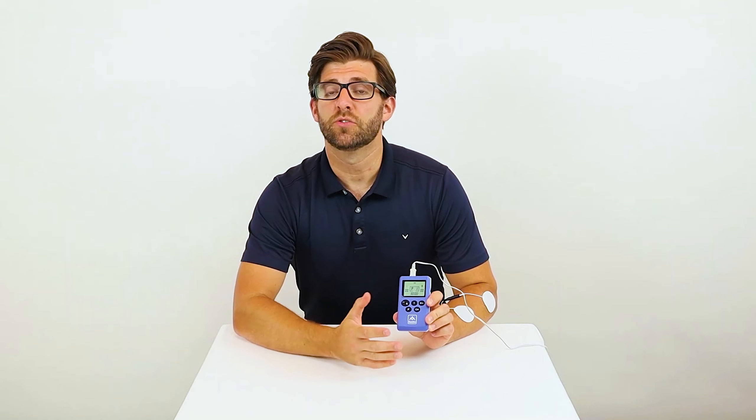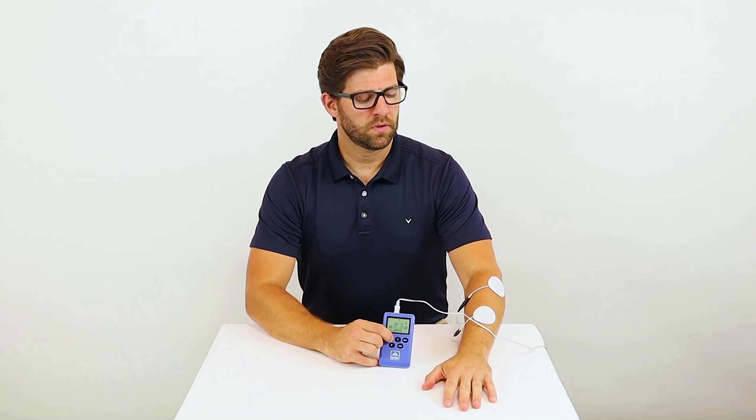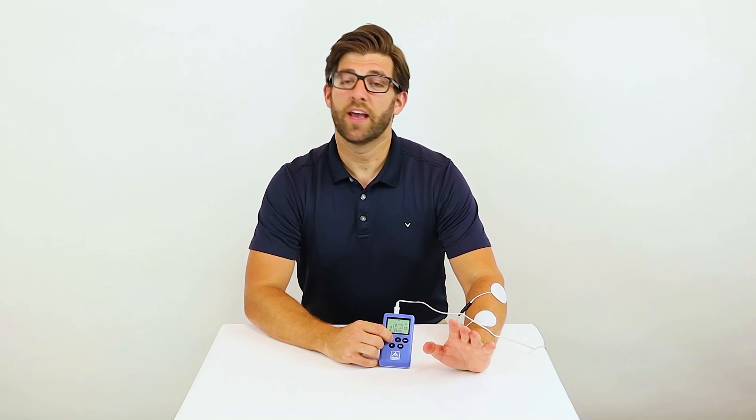Next push the P button to change to whatever program you would like. Remember there are 15 programs. I would like to switch to program 1. Then push the plus button to increase the intensity. Now I have stimulation.